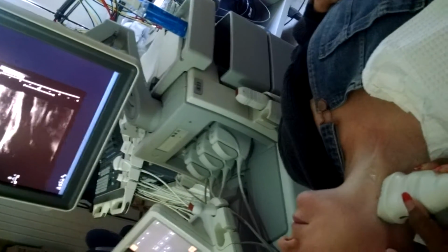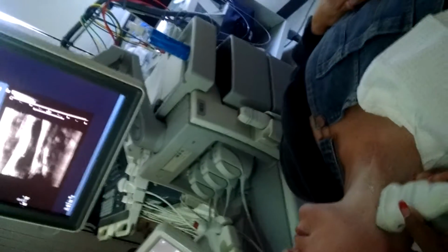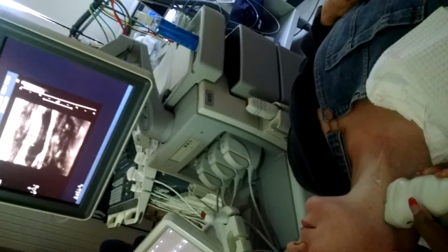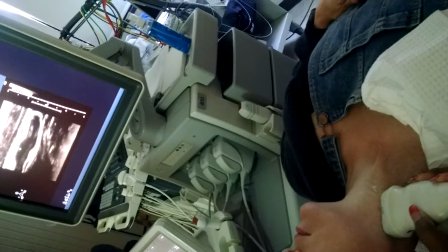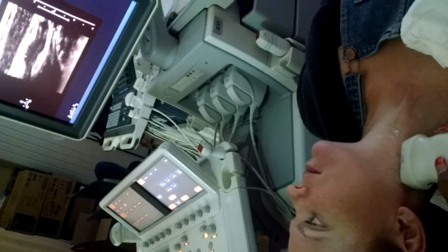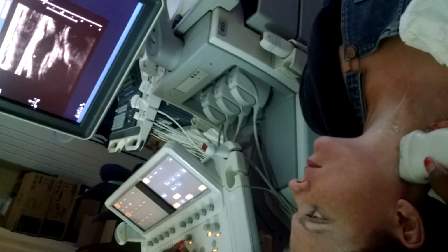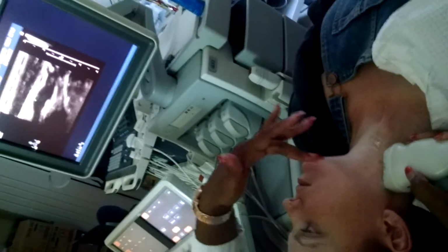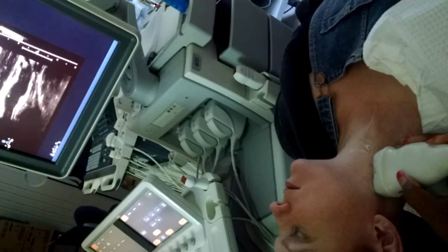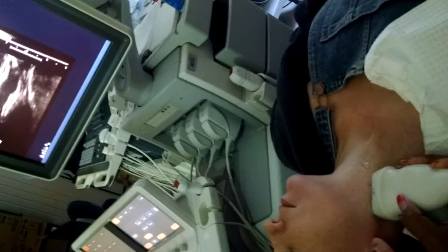You're going to move up. And then I'm just going to rotate. I don't know what the next image is I'm supposed to show you. Let's see. ICA, ECA? Well, the first one under the longitudinal is the proximal common carotid artery with IJV with color. Okay, that would have been down towards the proximal, but you just would have put color on. And then this is your bulb area, and this is your proximal ICA.